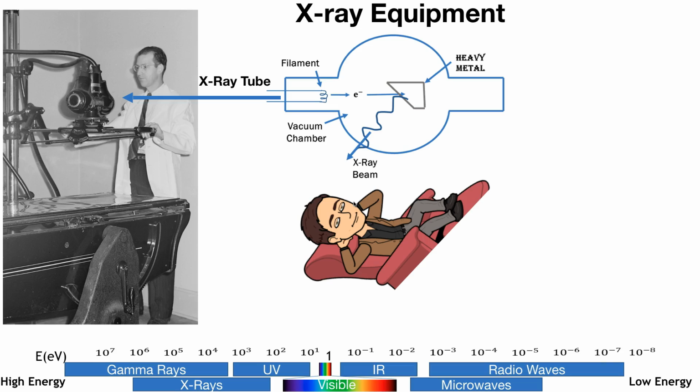The way that we have contrast in the signal in the detector is the x-rays are going to go through the object. They will be incident on that detector or film. Some of the x-rays are going to penetrate all the way through the object and will hit that detector and deposit a signal in that detector.